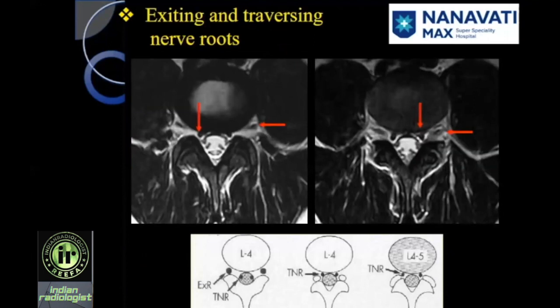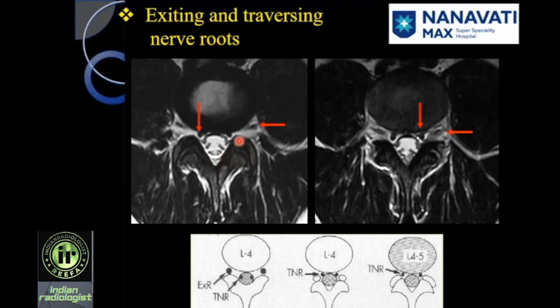Repeating the concept of exiting and traversing nerve roots. At the L4-5 level, you have the L4-5 disc nucleus pulposus, L4-5 disc annulus fibrosus, thecal sac, superior articular facet of L5, inferior articular facet of L4, facet joint, and ligamentum flavum. This is the traversing nerve root — at L4-5 level, L5 is the traversing nerve root. This is the exiting nerve root, so it's L4 at the L4-5 disc level. The importance of this distinction is described later when we talk about herniations of discs at different locations.